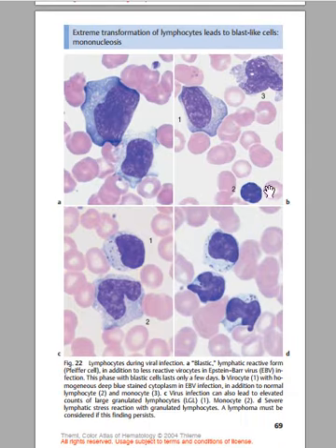So you need to visualize now how you see infectious mononucleosis on microscopy. So, lymphocytes during the viral infection. You need to know that during the viral infection you can see blast cells. These are actually blast cells.